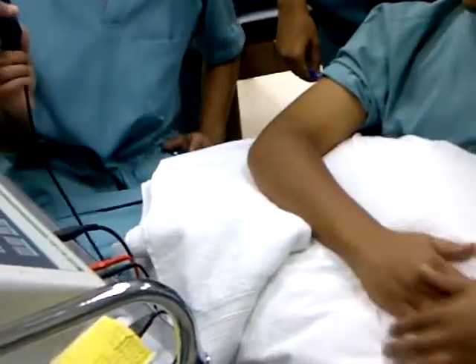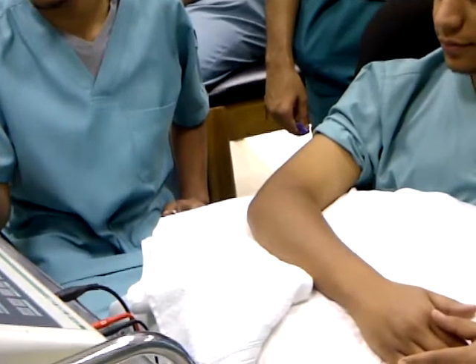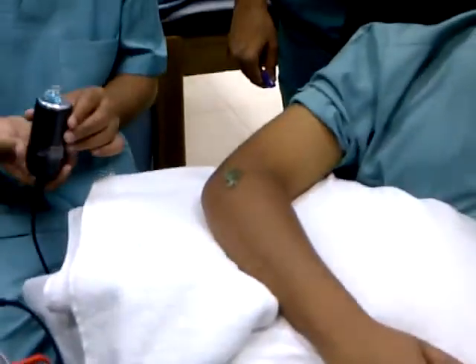Right. So you put some gel here, and also on the patient's skin. Put it liberally.